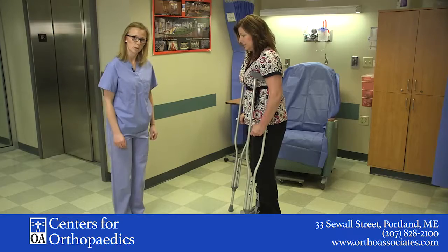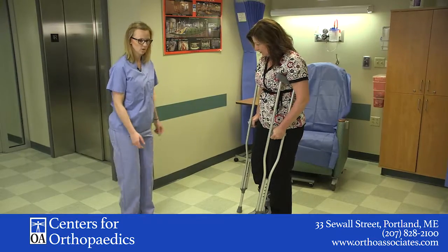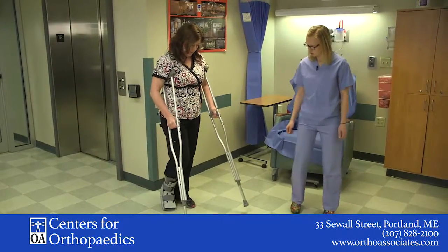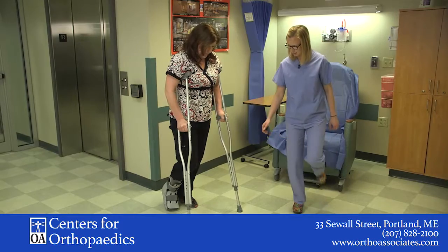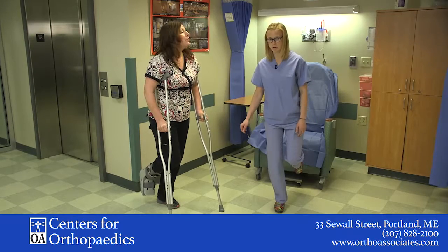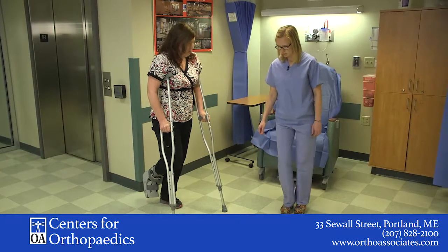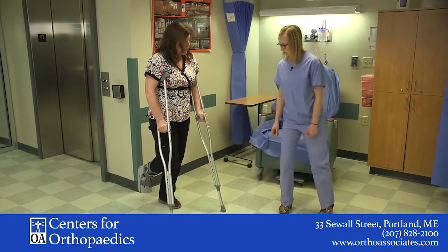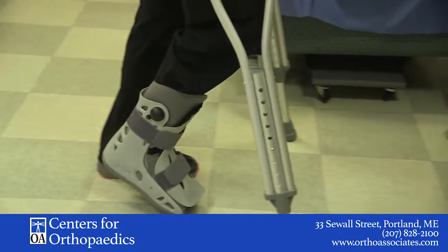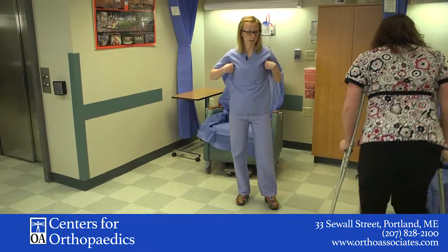So when we start weight bearing with the crutches, we're really going to put the weight on the palms of your hands. I'm going to have Donna come over here and show you how to start to walk with crutches. The first thing you're going to do is put your crutches first and either bend at the knee so that your foot is behind you. You don't really want the foot to be in front because it can cause some balance issues. So typically we recommend you bend at the knee, and Donna is going to put the crutches first with the weight on the palms of her hands and kind of step through with her good foot. Donna is not putting any weight in her armpits — it's really on the palms of her hands. She uses the crutch top a little bit for balance.